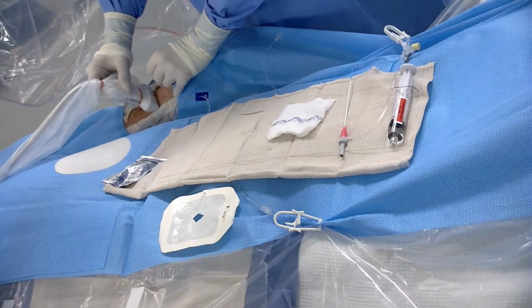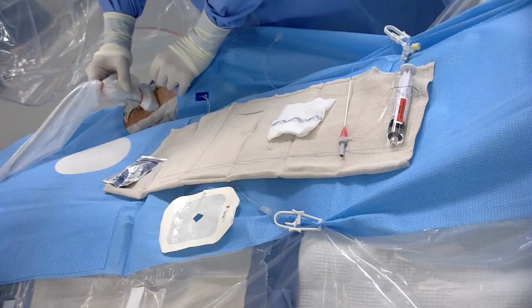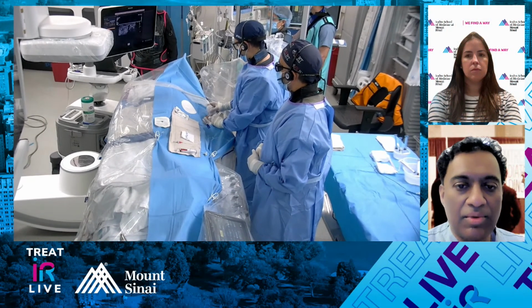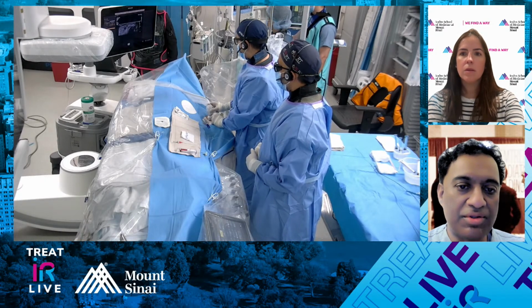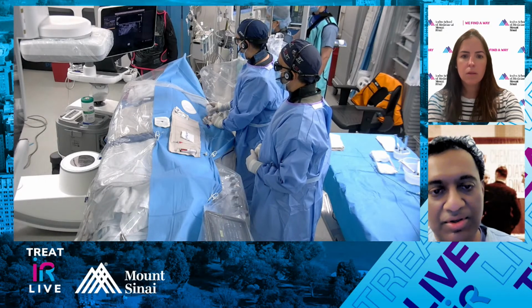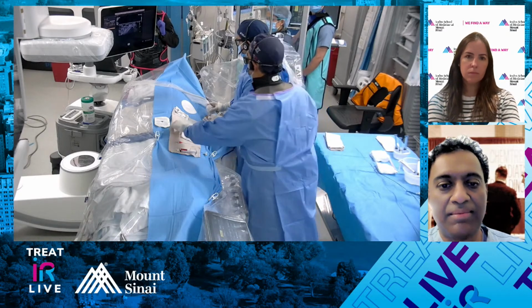Joji's case is a little interesting in that we see degeneration of the right distal extension, but the one thing we don't see is a really big obvious leak. His sac is growing slowly over time. We've done an angio before and didn't see a leak. That's not uncommon, unfortunately, with these kinds of type 1s. We'll think they're type 2s, but they're really occult type 1s. So I always look for circumferential seal in either the proximal neck or the distal limbs. I want 360 with contact for a centimeter or so. Otherwise, I'm really worried that an occult type 1 is the problem with that growth.